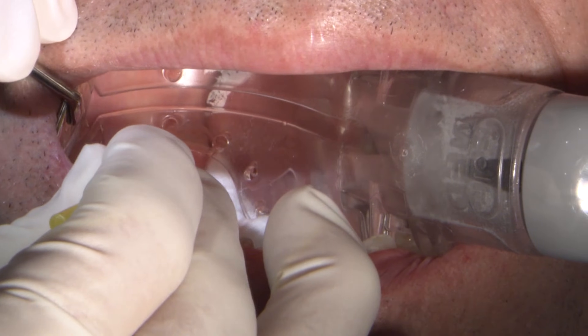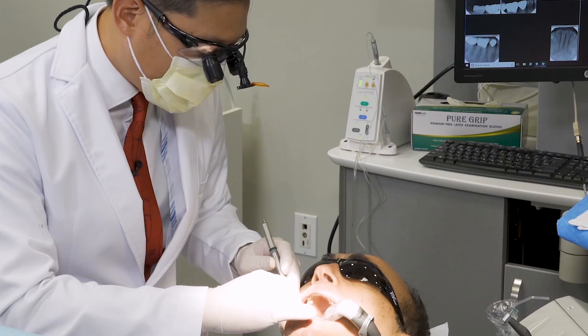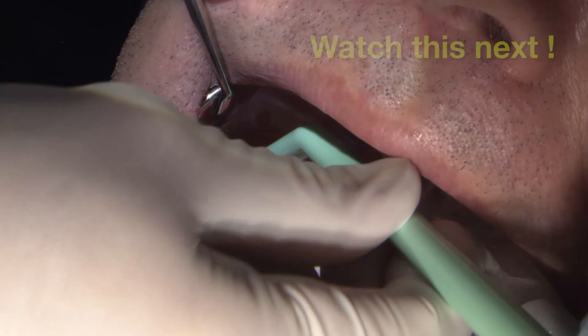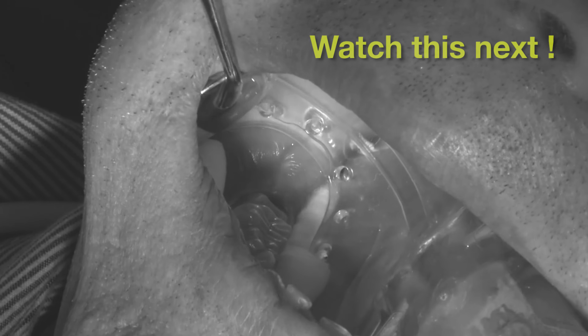If after the one or two minutes have elapsed I see a lot of excess of the desensitizing agent, then we'll blot dry it with a cotton pellet or aspirate the excess with a suction. So after some time has elapsed — one or two minutes — we'll lightly aspirate some of that excess and leave the solution on.